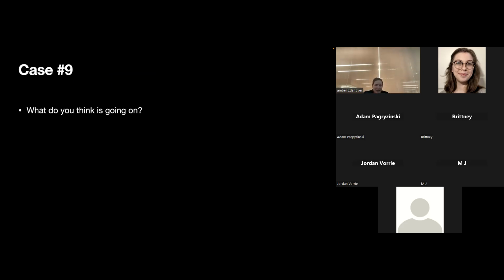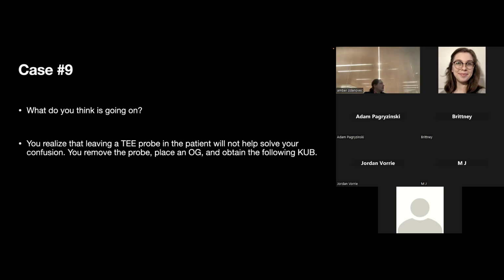Adam, you can't respond because I think you're on this case report. Yeah, I was there for that one. Thoughts? I had no idea. What's the time course of all this? We called, he came in, and you're just doing an echo to see how things look on peripheral ECMO because he still had pressure requirement, and you wanted to know if you had to worry about north-south syndrome with a well-functioning heart. So I had no idea. I said, I don't know, but leaving this TEE probe in a patient is not going to solve my confusion.